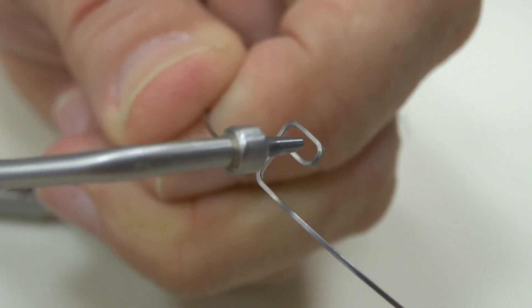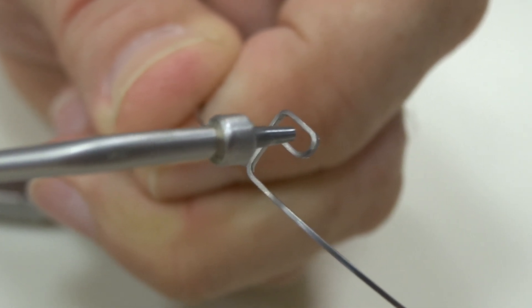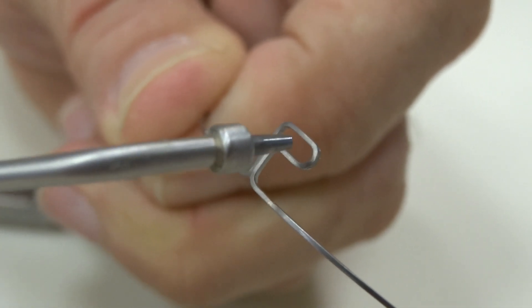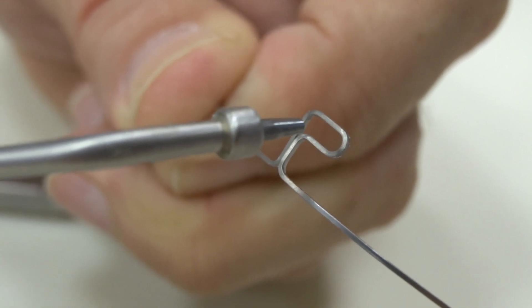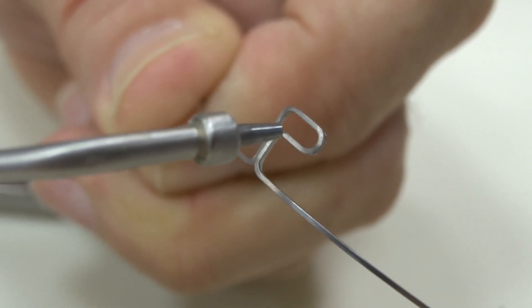One of the most versatile wires is a beta titanium wire in the form of a P, a Snoopy, or an L loop. These loops can be adjusted intra-orally very, very easily.